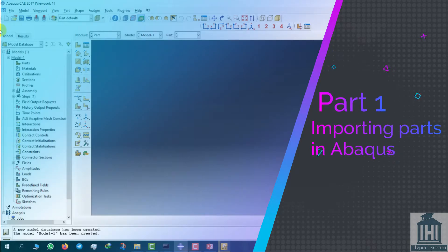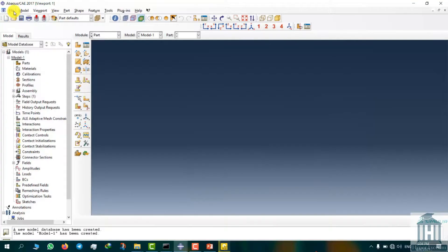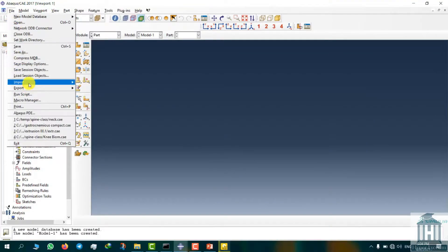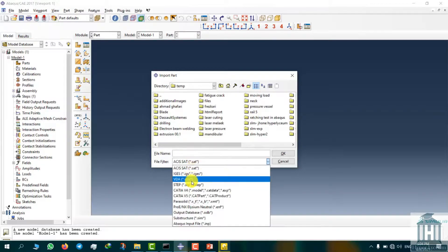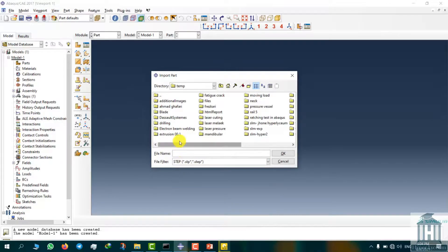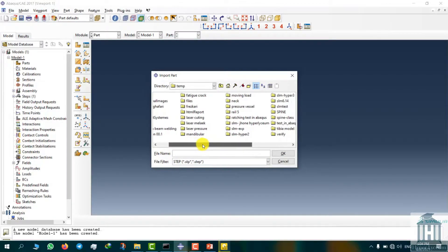First, we import the pre-designed parts under the Step format. Select input parts from the Files tab. Then, change the file type to Step and select the plate, screw, spongy and tibia models we have designed in advance.